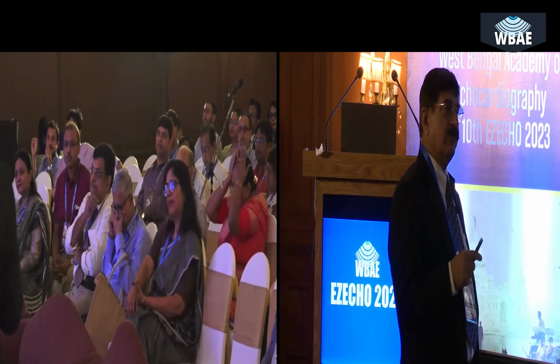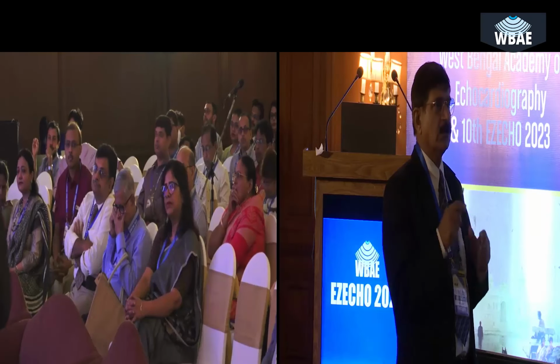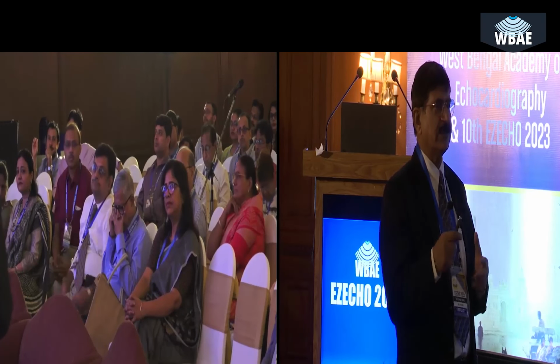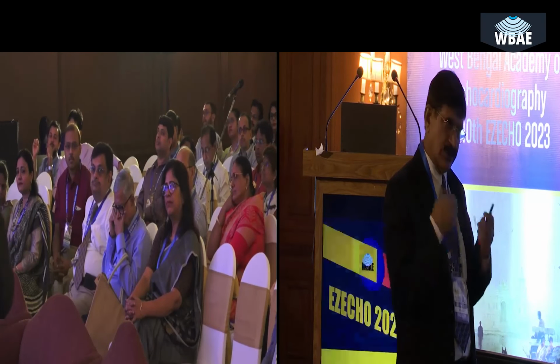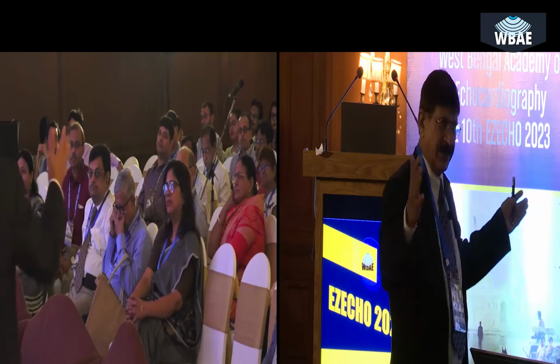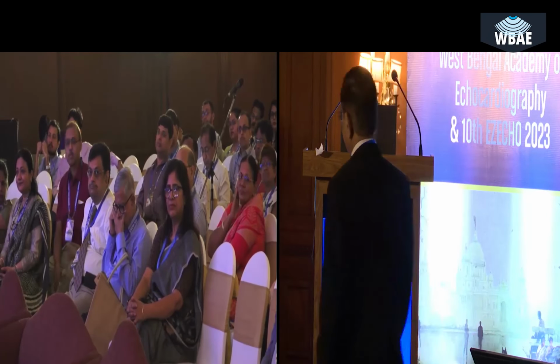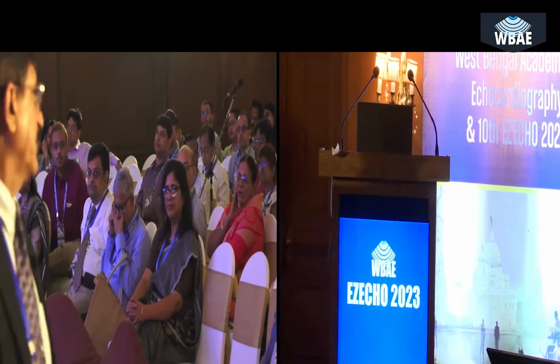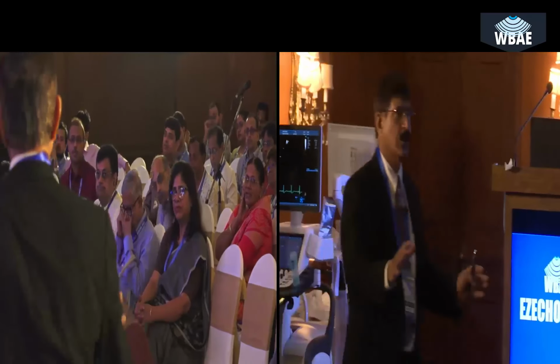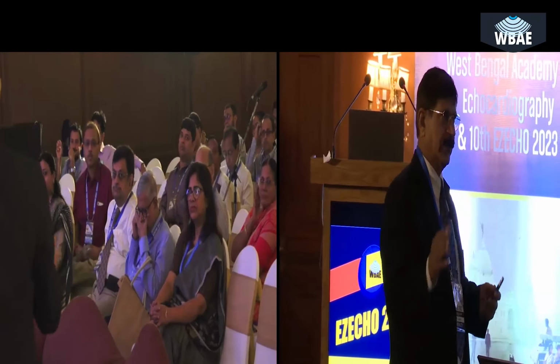We were looking for the 555 sign actually. If the systolic velocity, early diastole and late diastole velocity are all less than 5 centimeters per second, they are strongly suggestive of cardiac amyloidosis. We didn't do all these things, we were running short of time. More than one hour in such patients. We are acutely aware of the fact that there are many things we didn't do. We will actually talk about that in the afternoon. I am going to speak about that. So, we will talk about that.